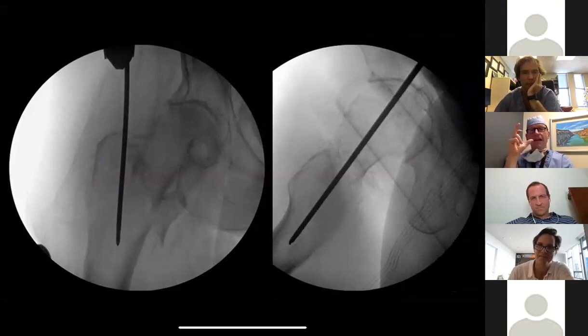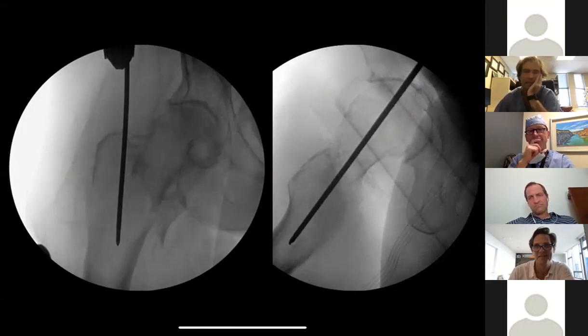All right, no open exposure. Doesn't the neck look like it's way too long or something on the lateral? Yeah, it's distracted. So doesn't that depend on the beam, though, right? The angulation that you come in with, right? So now we've uncovered. Remember, the greater troch was smashed, and so I felt as though we had just uncovered more of the neck with this X-ray view. Okay. May not be right, though, right? I don't know.